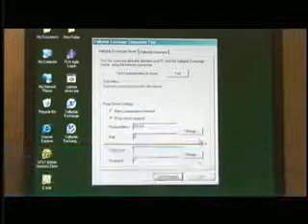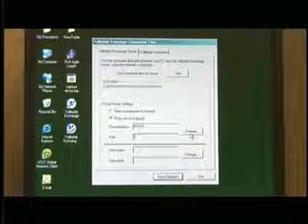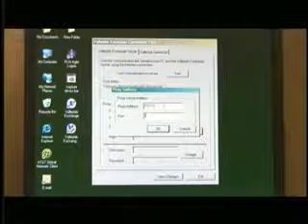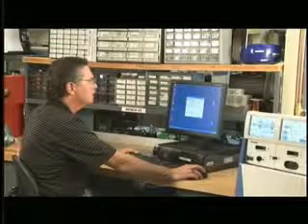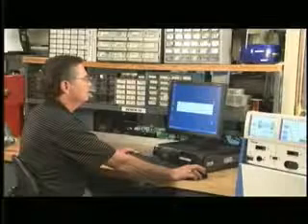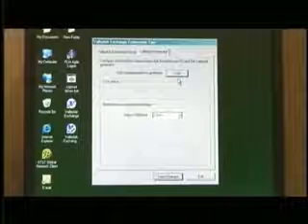To enter your facility's proxy server settings, select the Change button of the Proxy Server Settings section. These screens will allow you to enter your proxy server information and let you choose which type of authentication you would like to use. The Valleylab Exchange Software Update System Connection tool also gives you the option to check the communication link between the service PC and the Force Triad Energy platform. Select the Valleylab Generator tab from this screen.